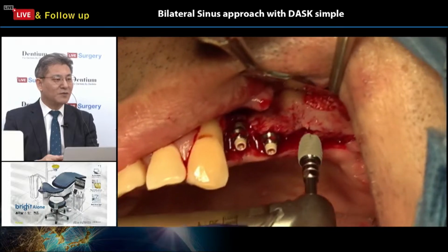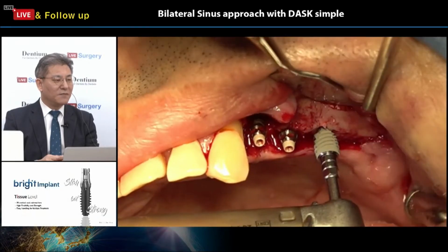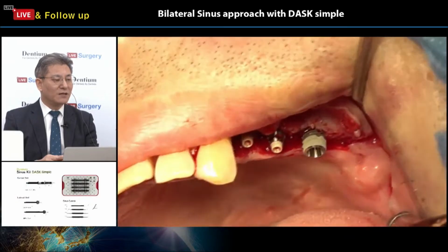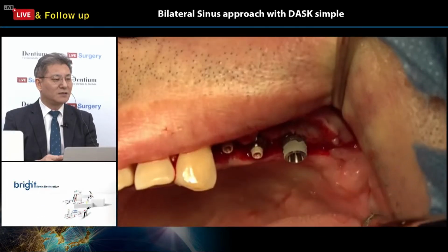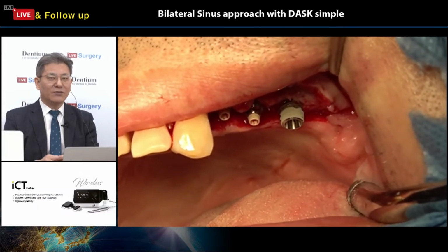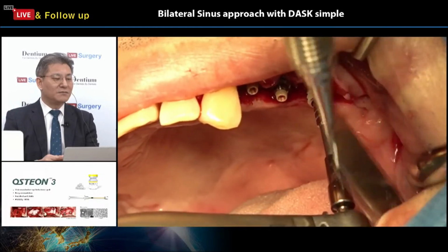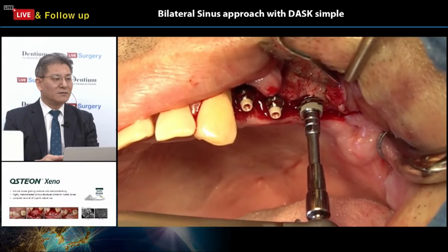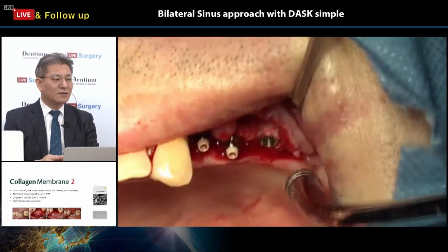Okay, actually after bone grafting, to try fixture installation. This one is a bone level bright implant. Yeah, 10 degree, 3.7 millimeter deep connection. Okay, good. Yeah.